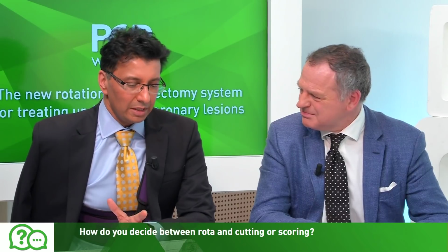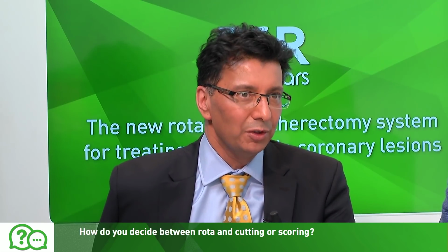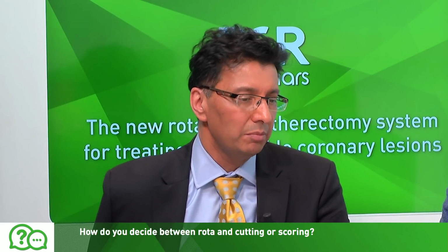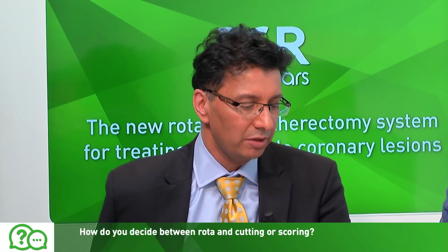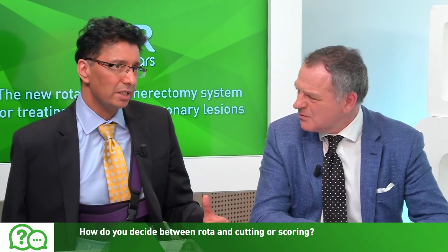Any thoughts? Yeah, I would agree with that. And also, I'm certainly not a fan of those balloons as a first-off strategy. In my experience, rotational atherectomy as an option to scoring or cutting balloons is a safer, more predictable outcome.